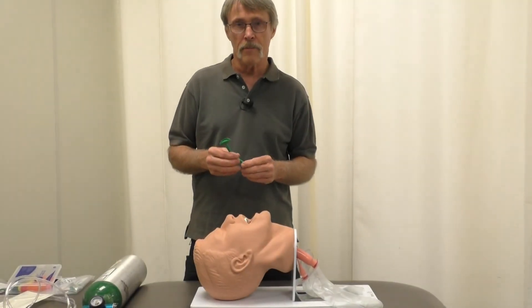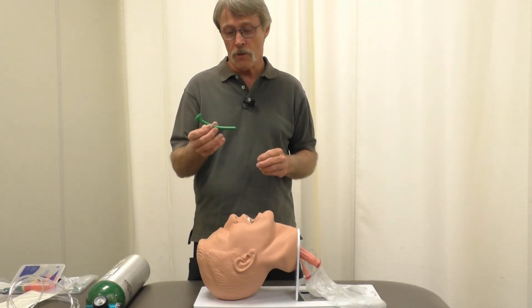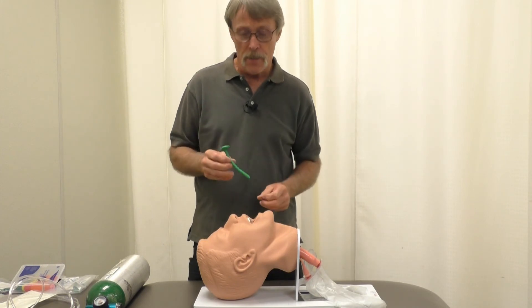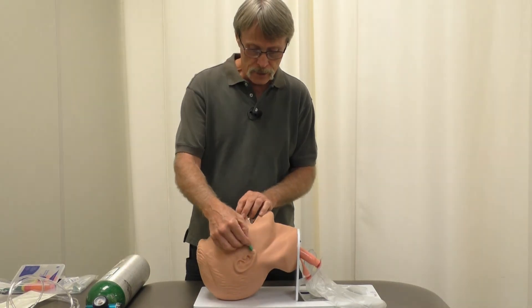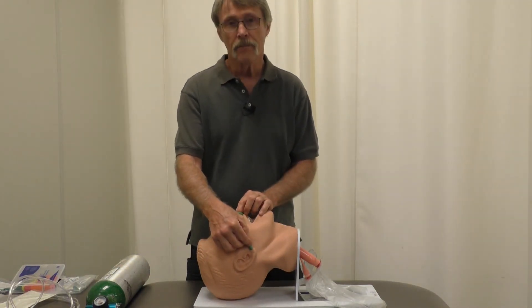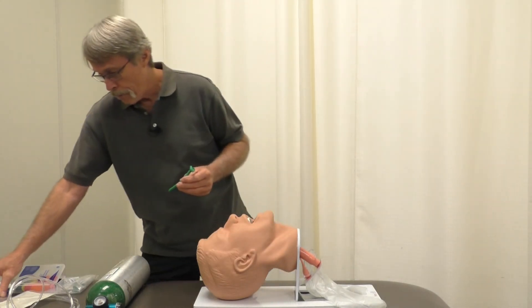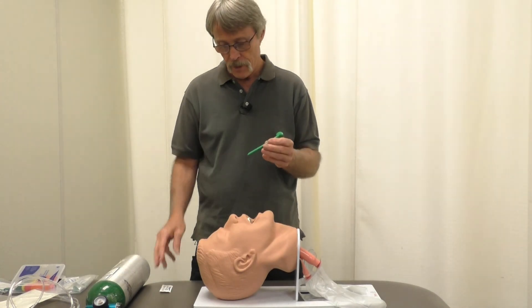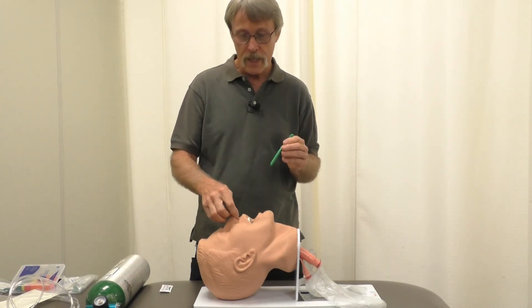Next, we're going to demonstrate the use of an adjunct known as the nasopharyngeal airway. You need to measure it properly — you go from the corner of the nose down to the tip of the ear to confirm fit. Then take it and lube it up with lubrication.